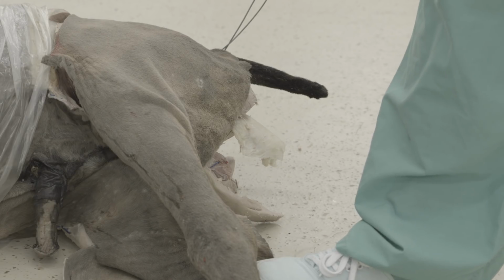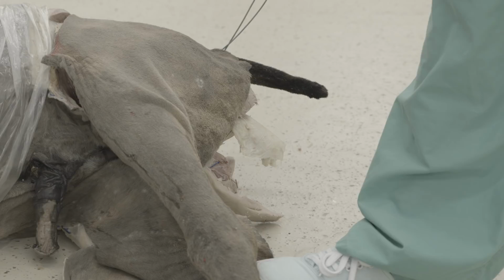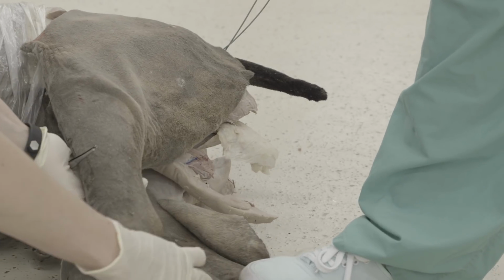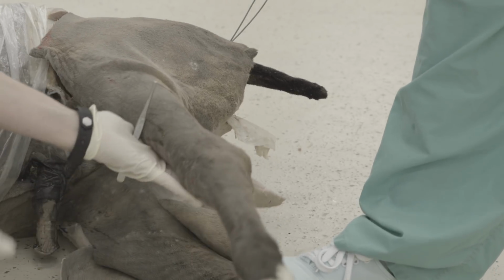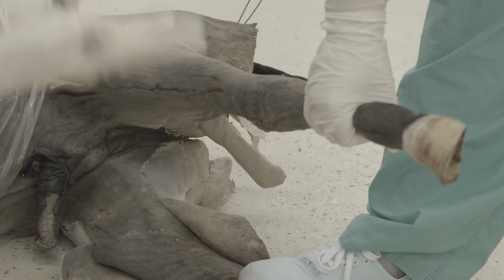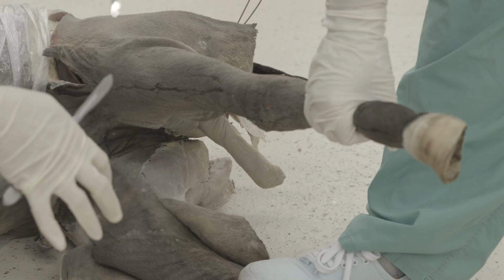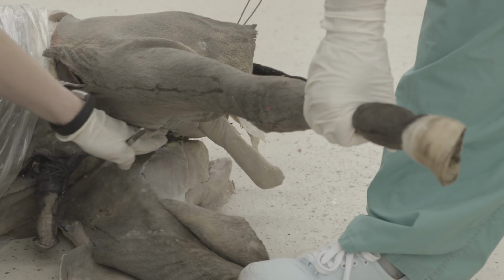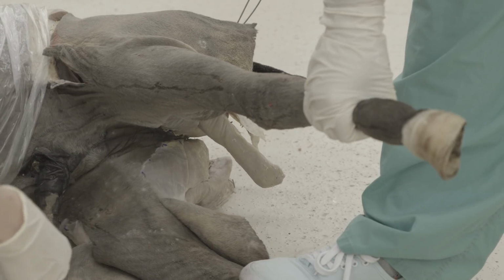So now you have your pony down on the floor in right lateral recumbency, and you'll need an assistant to help you. So your assistant will put one foot on the leg that's down. So you can see Anna has her foot right here on the leg, and then she's going to grab this leg and pull up. And as I cut, she's going to keep pulling that leg up to keep pulling it further and further away so I can cut through the rest of the structures that you're going to see down here. So it's very helpful to have an assistant.